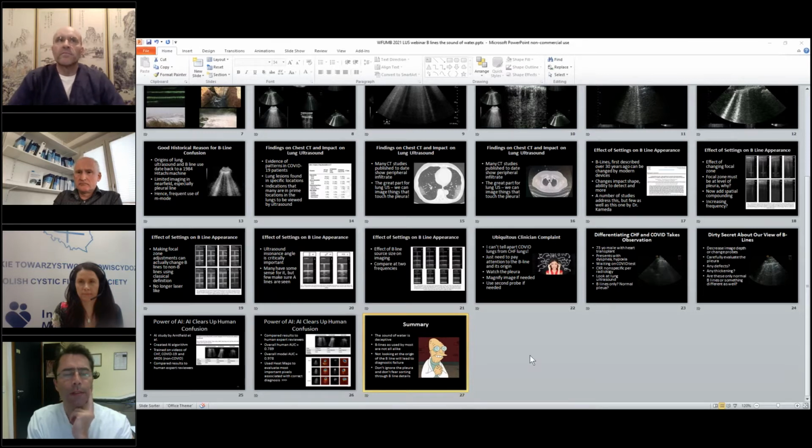Christoph, in a unit of internal medicine, if you are using lung ultrasound, it's pretty much the same as Michael explained. It's 1 or 2 minutes if I'm looking for multiplicity, multilocular subpleural consolidations, posterobasal in a sitting patient, and it's a very short examination. I cannot exclude anything by lung ultrasound. So I'm not looking for a solitary subpleural consolidation wherever I can see it. I'm looking for multilocular, many of them. I see the B-line artifacts.